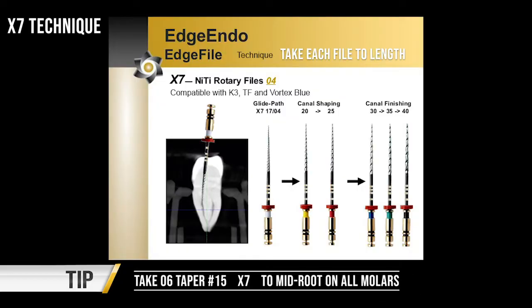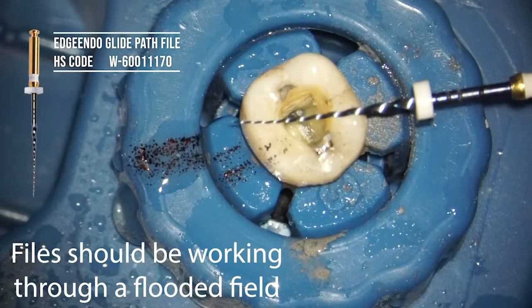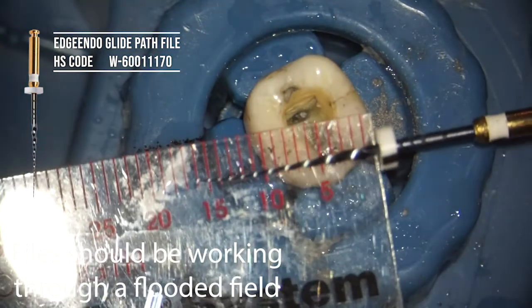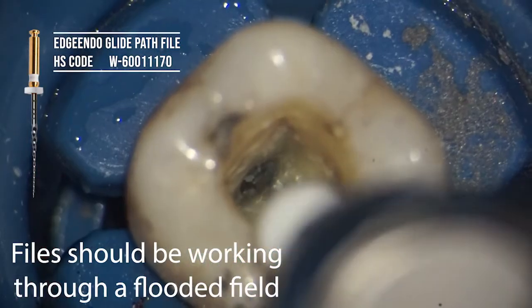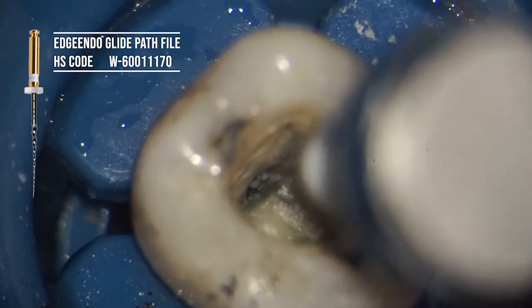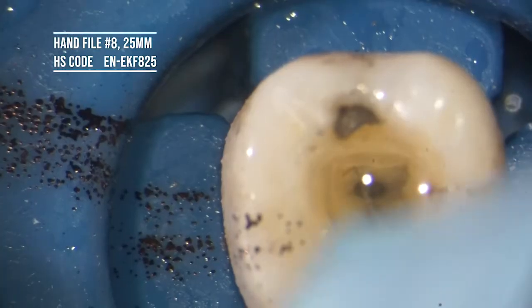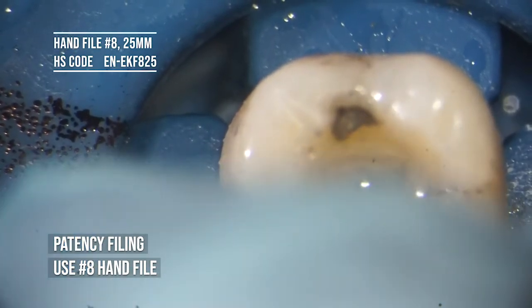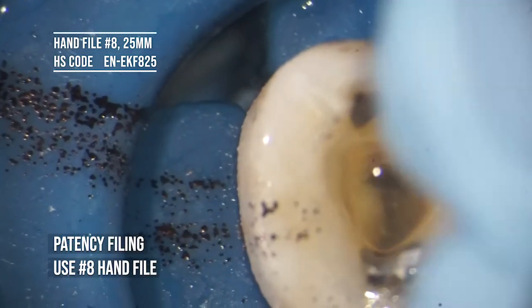The X7 is a wonderful file system, one of the most flexible on the market. Actually, it's only a 3-file system, and then you can add a glide path at your leisure if you require. I'm just working up to the confluence here on the buccal. So down we go, sliding down to the buccal, and because the confluence of buccal into the lingual isn't that pronounced at the curvature, we'll actually be able to take the X7s down to full working length on both the mesial and lingual. Always use a patency file just to make sure you're not blocking out with dentinal debris, and that's what we're doing here.